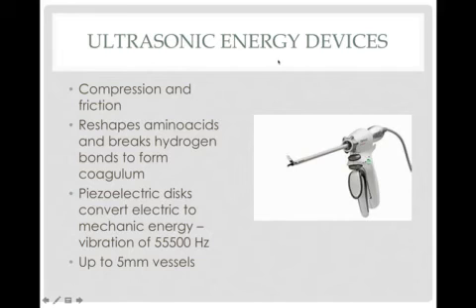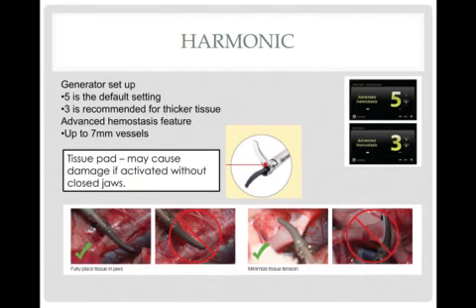And then we have the ultrasonic devices. This is the Harmonic. They use piezoelectric discs and can ligate up to 5 millimeter vessels.